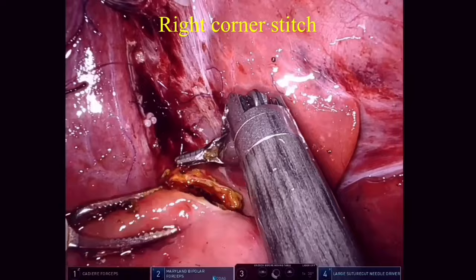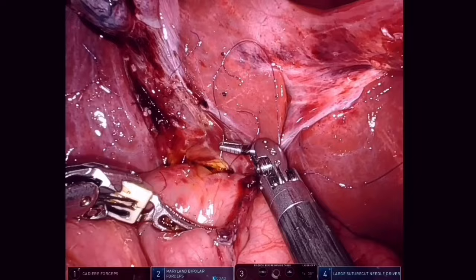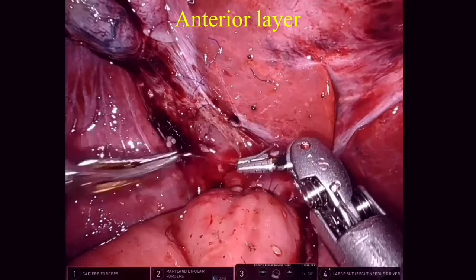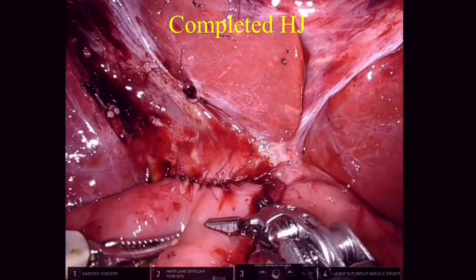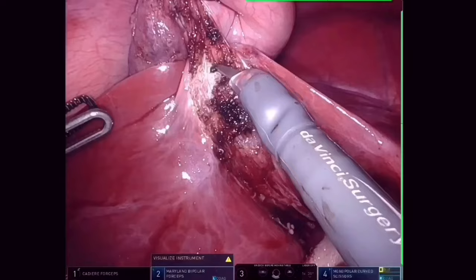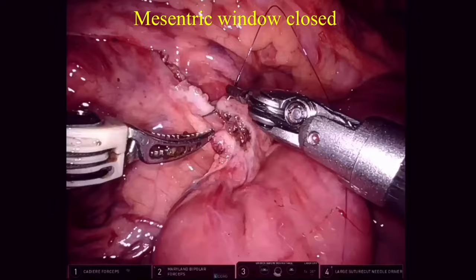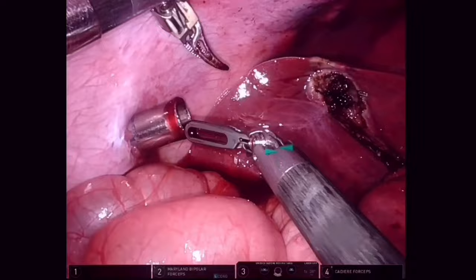This is the right corner stitch and we see that the posterior layer is complete. The anterior layer is again done in a similar fashion with interrupted sutures, and here we see that the single ostia hepaticojejunostomy is completed. The gallbladder is then removed from the gallbladder bed. The mesenteric windows are closed. The specimen is removed and a drain is placed in the subhepatic region.